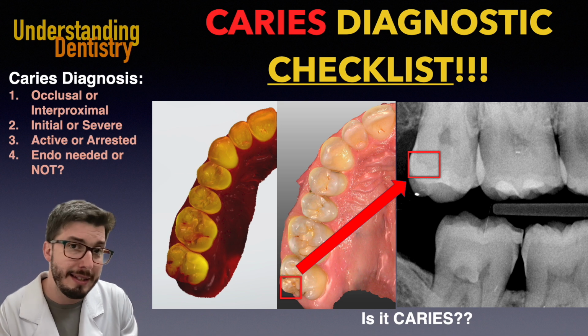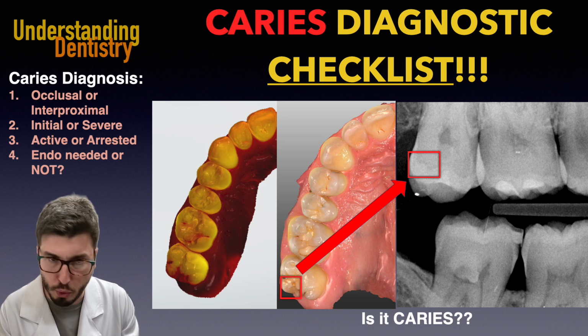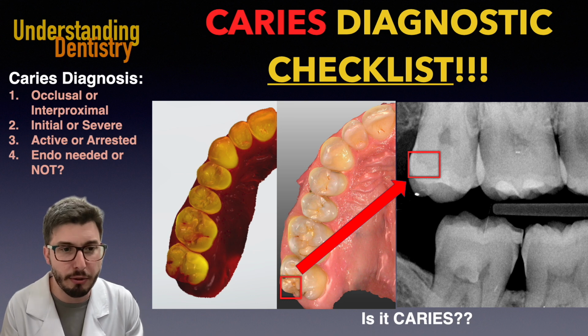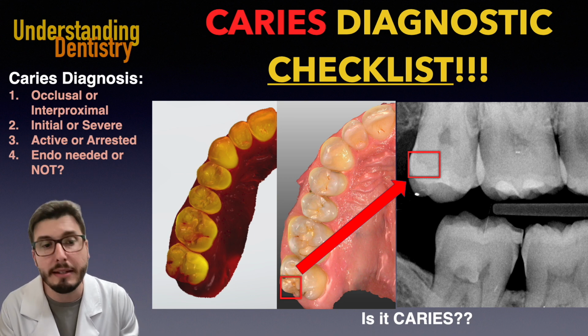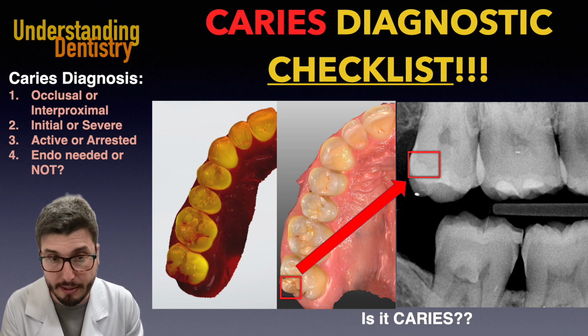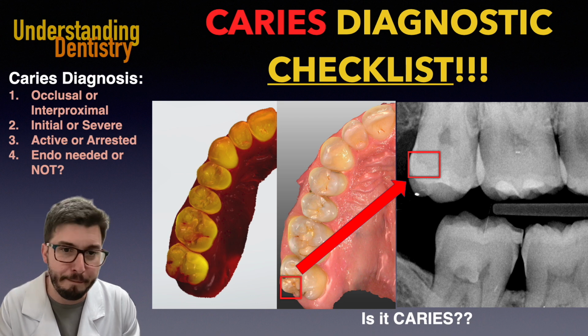And of course, this is a tool still under research, but you can use it as an additional tool, okay, not replacing the gold standard methods, but at least as an additional tool for you to see the features that have higher risks, or even the places that you have the caries, okay? So it's something that will help you in your treatment plan.